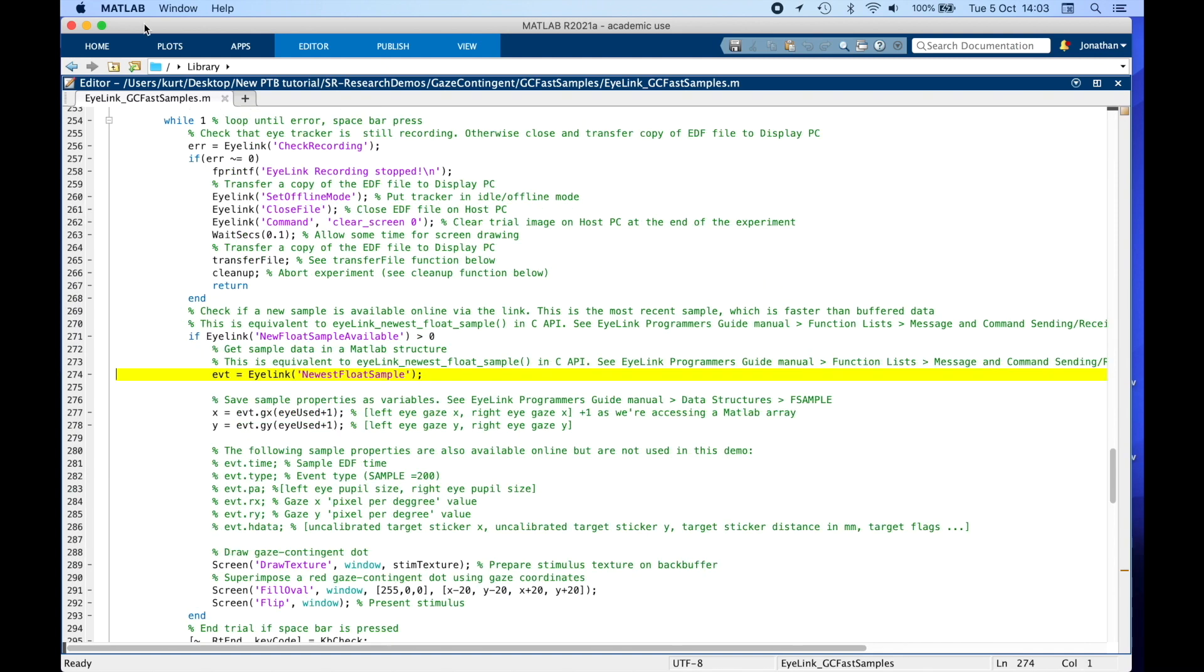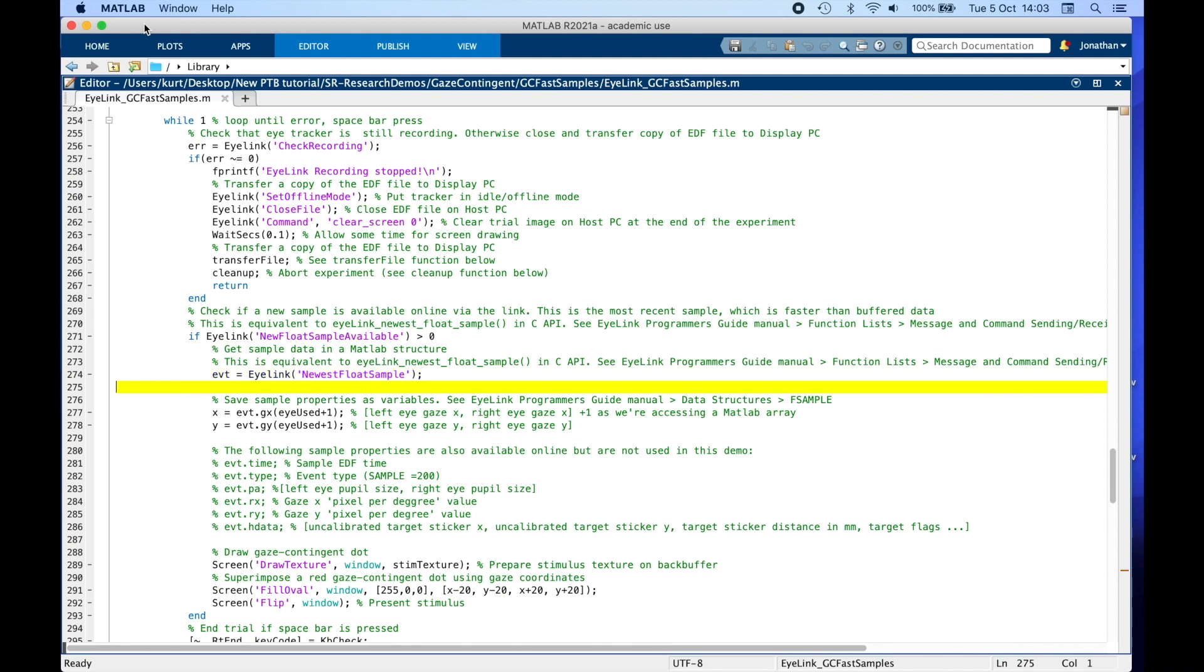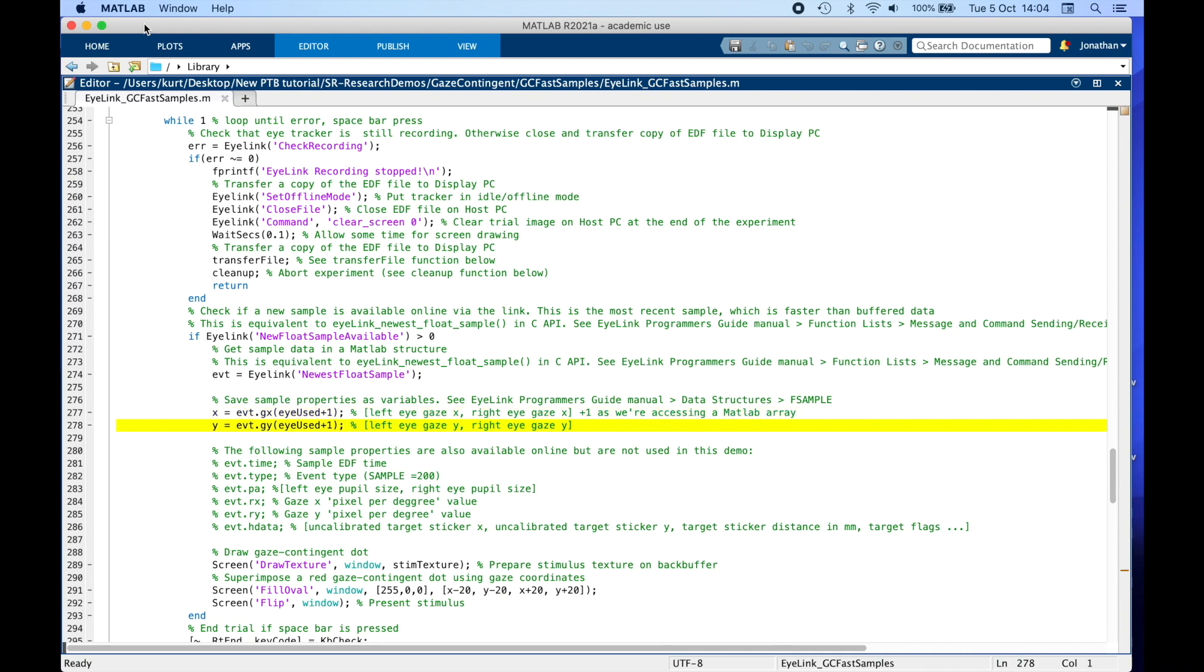For this demo, we are interested in retrieving gaze, so we require GX and GY. As soon as we get a sample, we can save the structure as EVT and access gaze position as EVT.GX and EVT.GY at every iteration of the while loop. Here we are retrieving gaze for the eye we want, via the eye used variable we created earlier to index the gaze data array. We are saving the gaze position in the variable X and Y, which are the gaze X and Y coordinates.